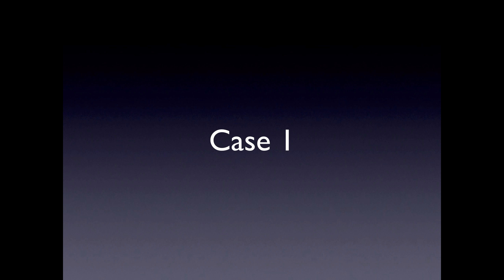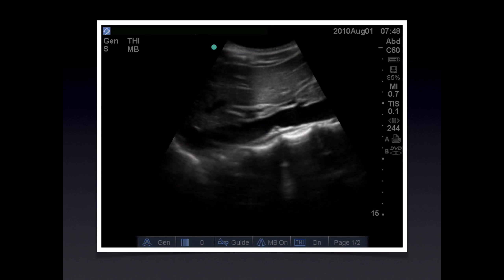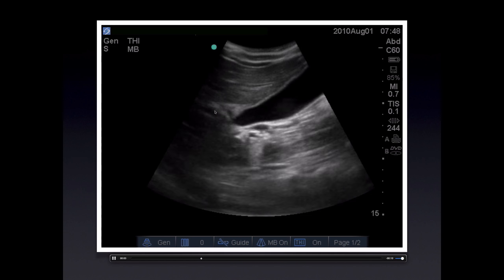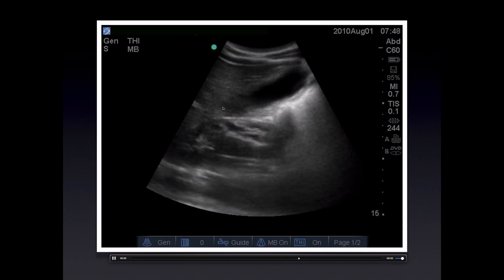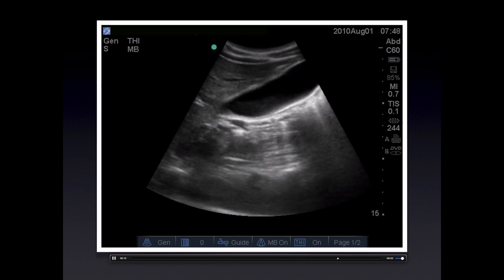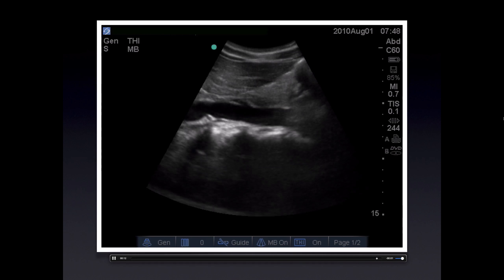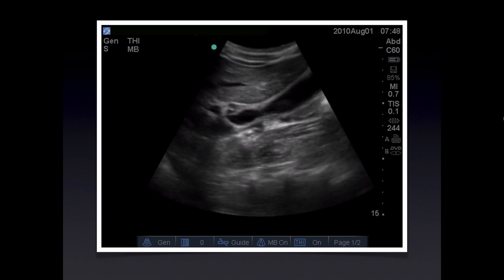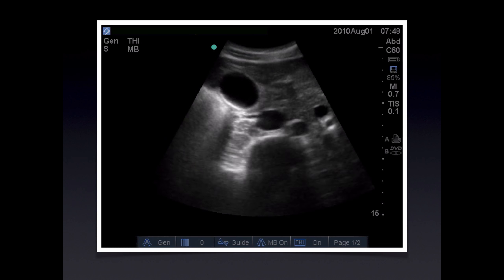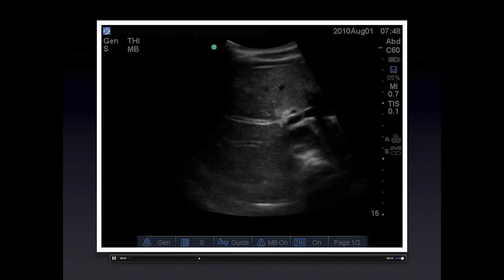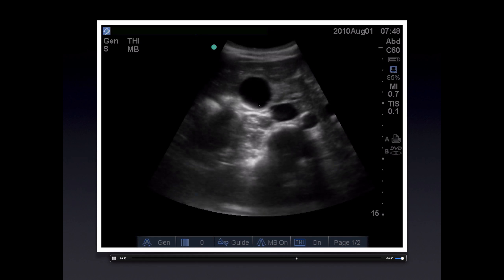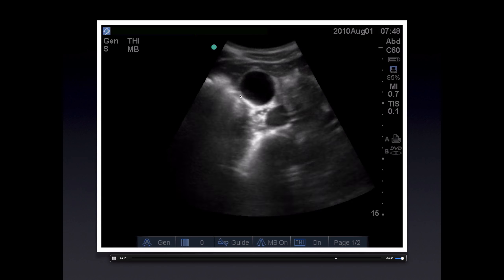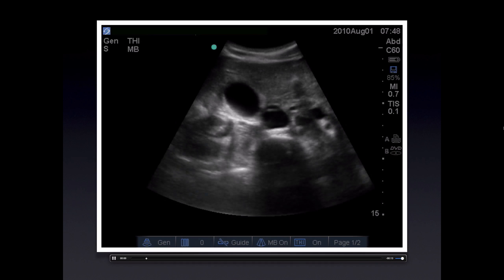Now let's take a look at some pathology. Case 1: identify the portal vein here, this is the gallbladder neck through its relationship to the portal vein, and therefore this is the gallbladder fundus. We're sweeping through it in sagittal plane — there's nothing seen within it. Same sweep in transverse plane: we're following the gallbladder to the top, portal vein, common bile duct, and sweeping back down through the gallbladder. We don't see anything within it, there's no gallbladder wall thickening, there's no pericholecystic fluid — this is a normal exam.